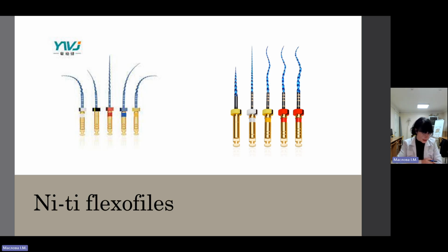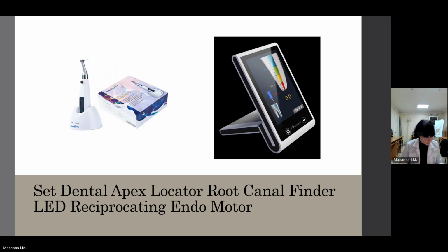Power-assisted root canal instruments. What does that mean? Many different power-assisted root canal instruments have been developed over the years in the hope of making root canal preparation quicker and reducing operator or dentist's fatigue. Reciprocating handpieces. These handpieces impart a mechanical action to the root canal instruments to cut dentine.